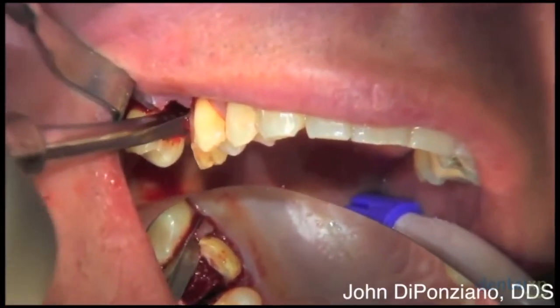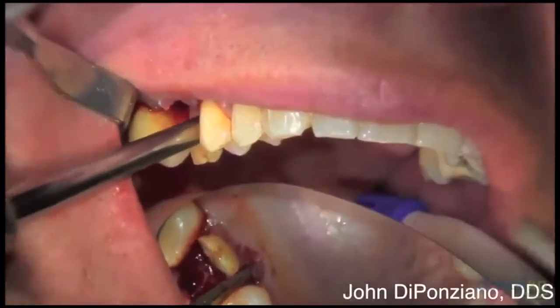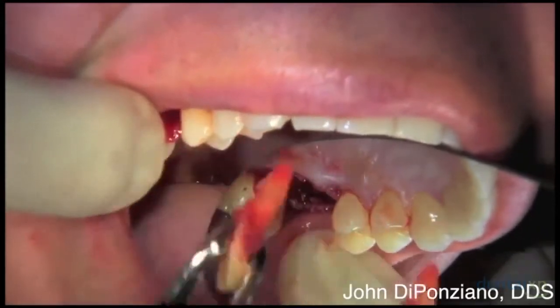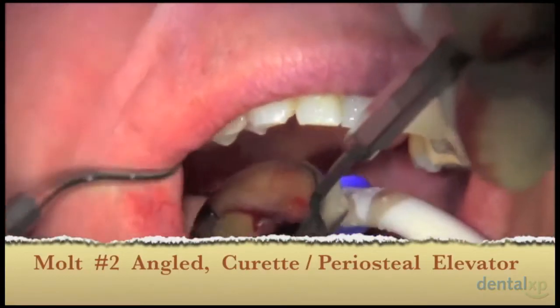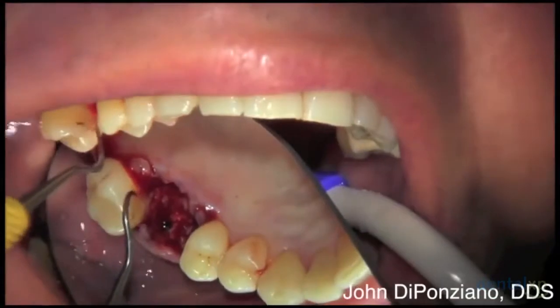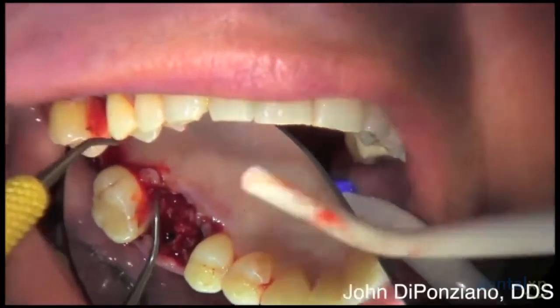This is the palatal root being elevated coronally with a larger straight elevator. Once the coronal movement is established, it's easy to extract the root. A Molt number two angled curette is used to clean out any granulation tissue, and a scaler to get the calculus off of the second molar.